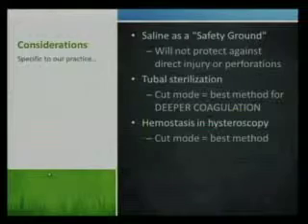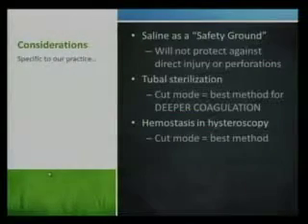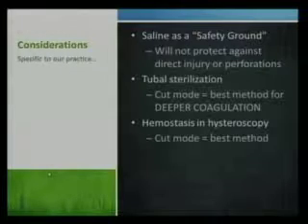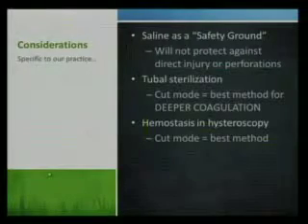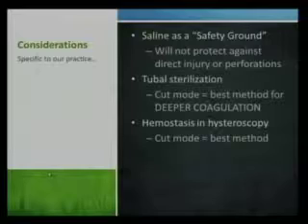A couple things that I just think are interesting. So I read about using saline, which is a conductive solution, as a safety ground. I've never seen this done. I don't know that I'd ever do it, but I just thought it was interesting. So you can fill the abdomen with saline, a conductive solution that can help disperse the current. And that way, you antevert the uterus, you lift everything up out of the saline, and if you were to have like stray current, if you were to have an insulation failure, it would protect the bowel from injury.